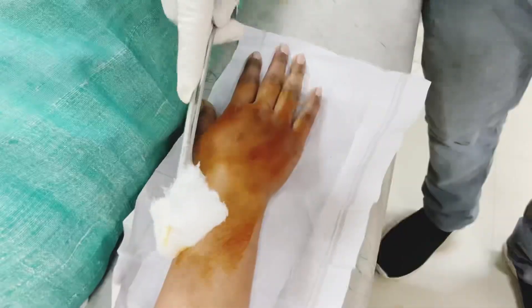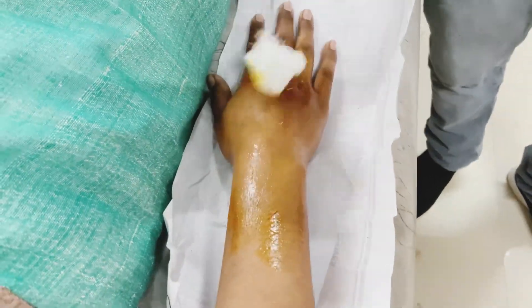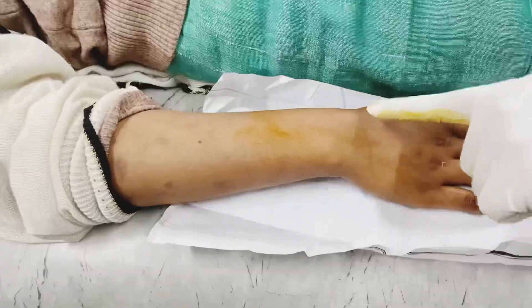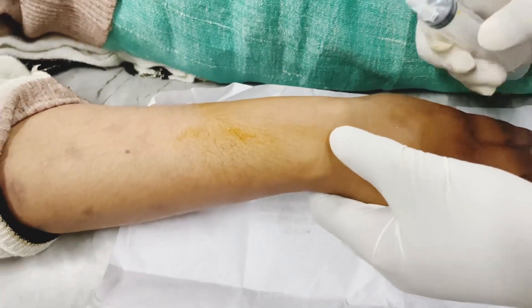After positioning the patient, I am preparing the site with povidone-iodine and spirit. You have to use a large bore needle — here I am using a 16G needle.